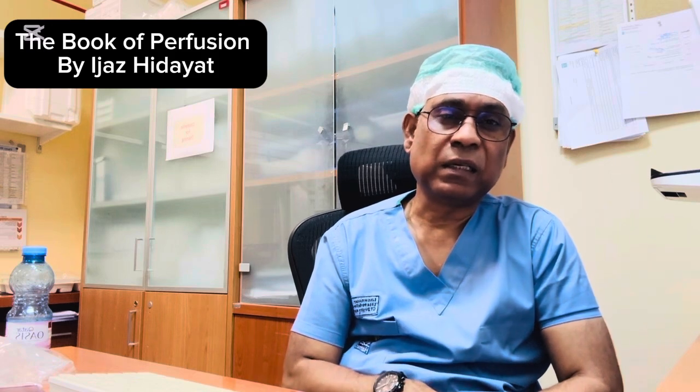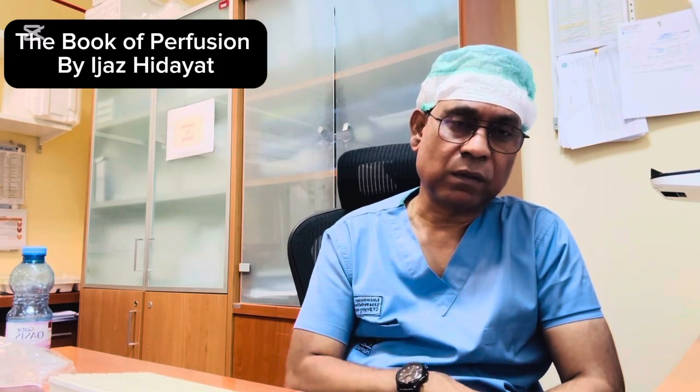Nurses have their own role to assist the physician or the surgeon at the time of cannulation, and the intensivist and the bedside nurses have their own roles in case of the ECPR, such as maintaining the patient's ventilation from the ventilator side. Meantime, we start our ECPR or ECMO activation, ECMO initiations.